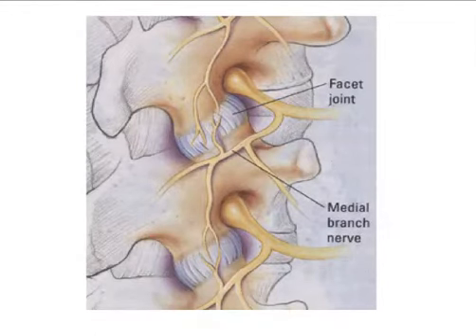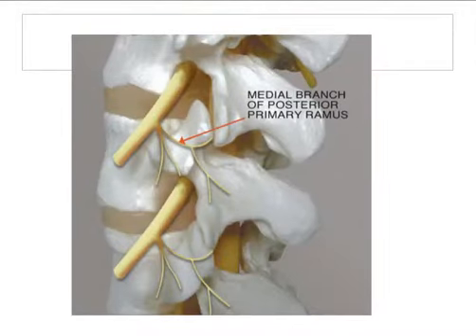Here's another image of it. Once you're in the facet joint, you'll get all that cartilage, the articulation. You'll also get these nerve branches. Once again, another cool image, because once again you're going spinous process. Here they are sticking out there. Needles coming right through, straight into that formation there, right into the facet joint.